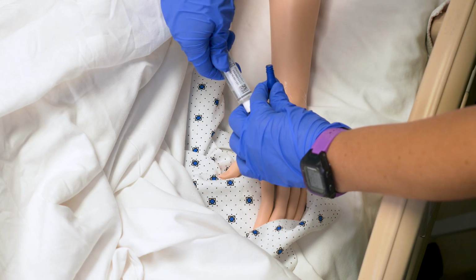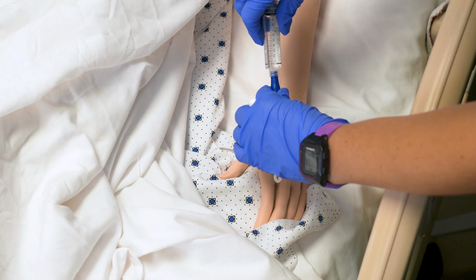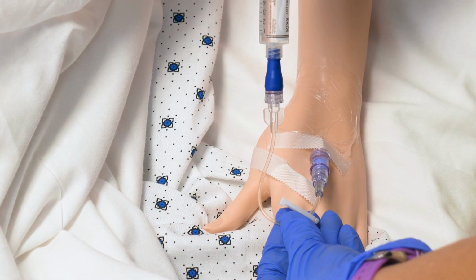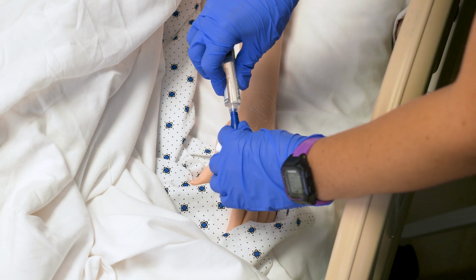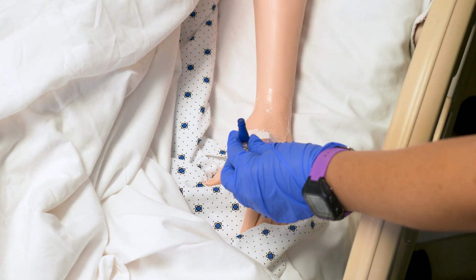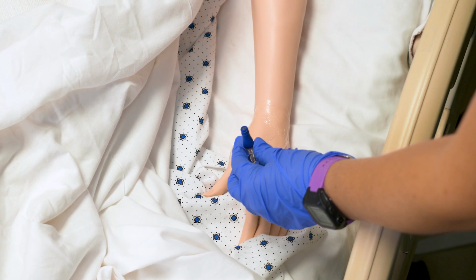I'm going to remove the cap from my normal saline, attach my syringe, unclamp my tubing, and flush with the 5 mLs. So I'm disconnecting my saline. These saline syringes are one-time use, so you cannot use it again. I'm not touching the end of that, and now I'm going to connect my IV tubing.